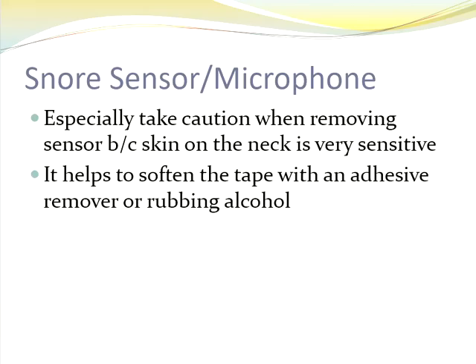Sometimes you might find, and I've found this a lot in previous years, that students have trouble getting the snore sensor tape to stick to the neck. It could be because a lot of people use lotion on their necks, things like that. Remember, this is not an area that we actually prep.